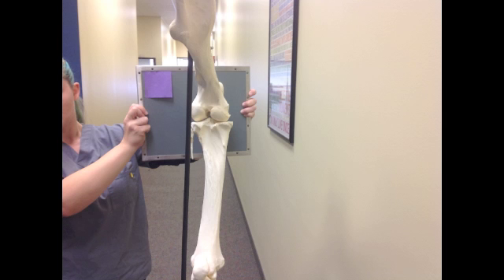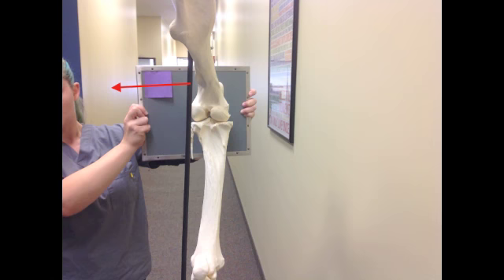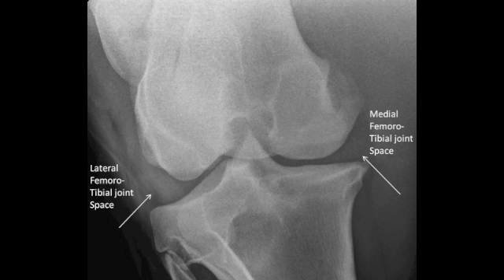The horse should be standing comfortably on all fours. The plate holder should stand off to the side of the horse and place the cassette against the cranial aspect of the patella, nearly touching the horse, which will give you a good view of the femoral tibial joint.